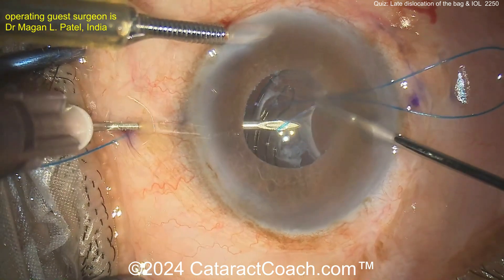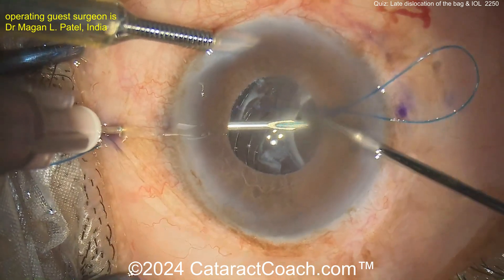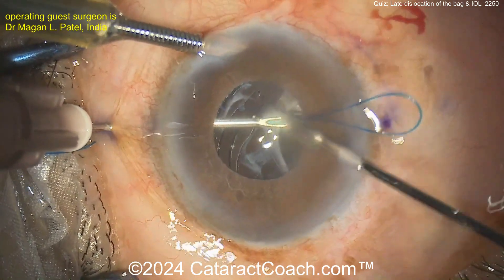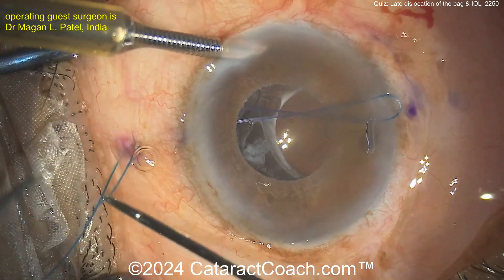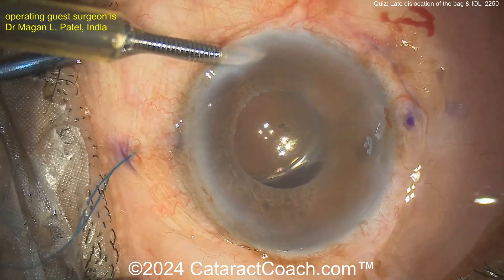Now you create flanges here with the polypropylene — the prolene. Make sure you really get the little nubbin of it into the sclera. You don't want a big wad of polypropylene sitting just under the conjunctiva because it will erode through. Pull the loop through, get those trimmed up and cauterized, and do the other side.